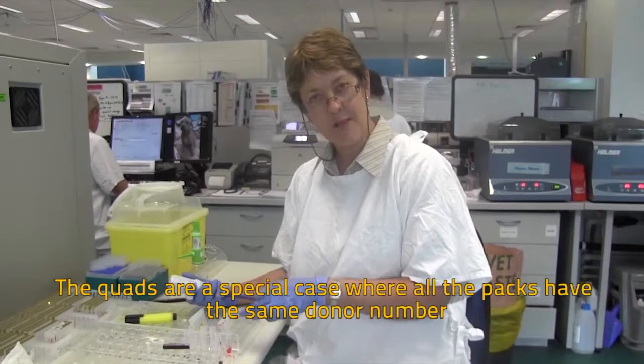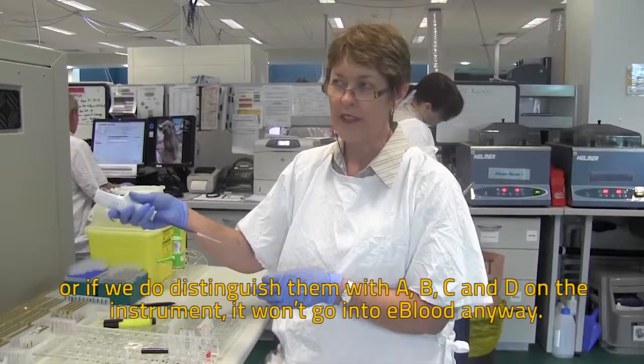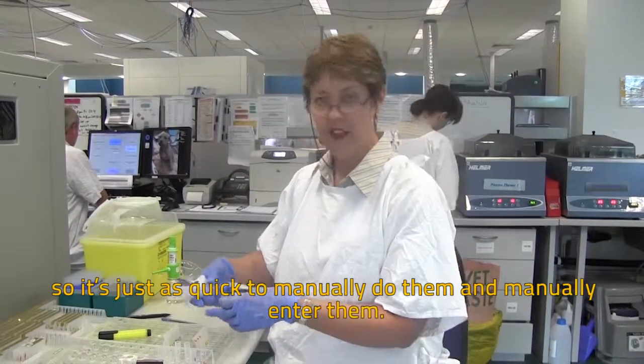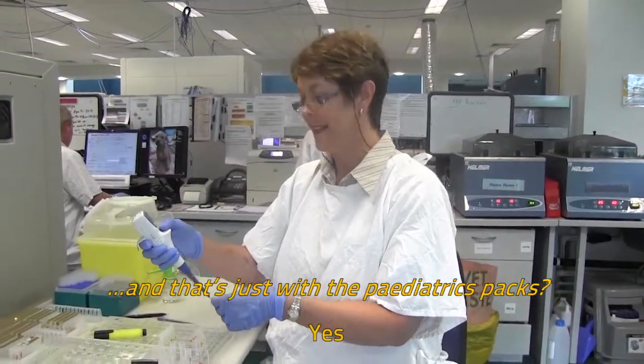The quads are a special case where all the packs have the same donor number, making it more difficult for the instrument to distinguish them. Or if we do distinguish them with A, B, C and D on the instrument, it won't go into eBlood anyway. So it's just as quick to manually process them. And that's just with the paediatric packs? Yes.